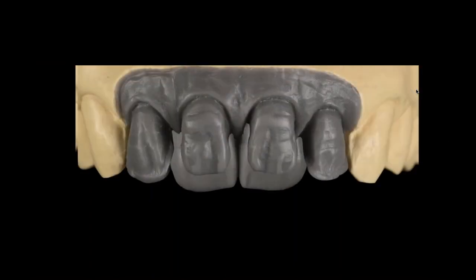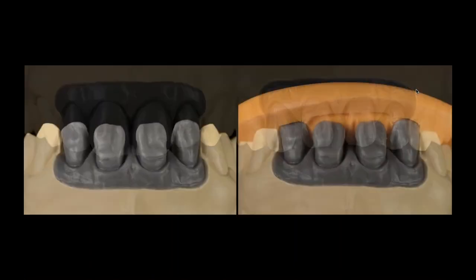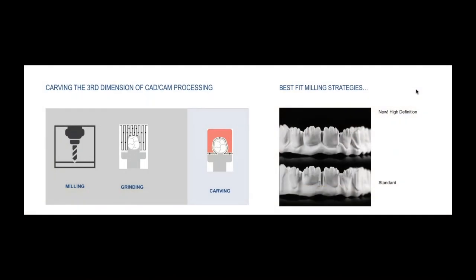Now, the next part of this challenge is that I'm going to have to make this cutback transform into our zirconia material. And to do that, obviously, I need some accuracy. So I said in the very beginning that I think the technology is great today. And I think what separates the men from the boys in these scenarios is really about the little details. There's not a scanner or a milling machine out there that cannot mill a coping that fits okay. I think that's kind of easy stuff today. But the real challenge for me is, can I scan all that detail that's there, and can it be milled as accurately as possible? That's our challenge in the secondary milling components, or the communication between our scanning and milling. Is it there enough? That's what we call that final carving process.